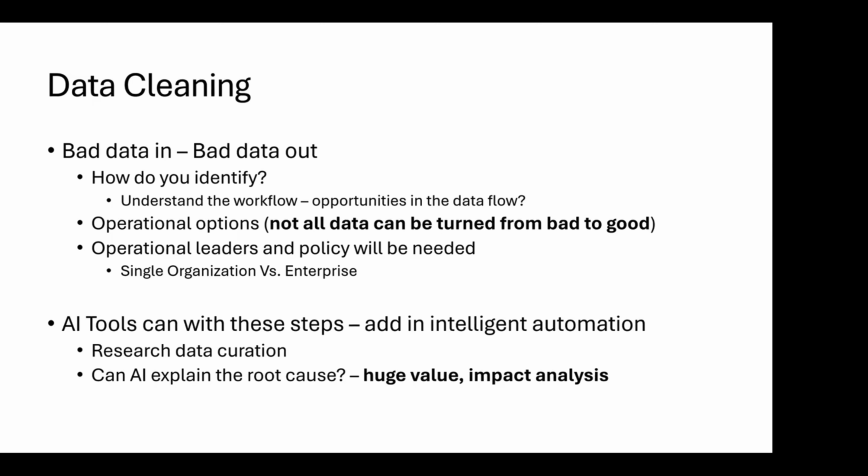The other thing that AI might be able to do is help explain some of this bad data scenario. When Don was talking about the evaluation slide, when we were doing analysis of one of our PAC systems that we were migrating off of, we found like 2 weeks where the data was just horrible. And it also correlated with a major PACS downtime catastrophe that we had.